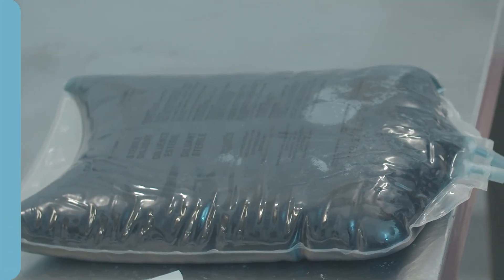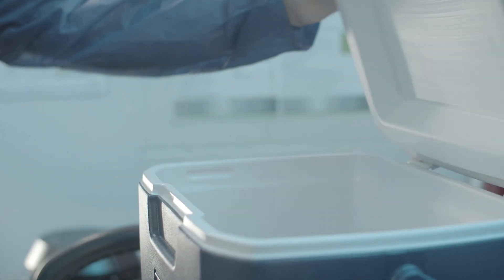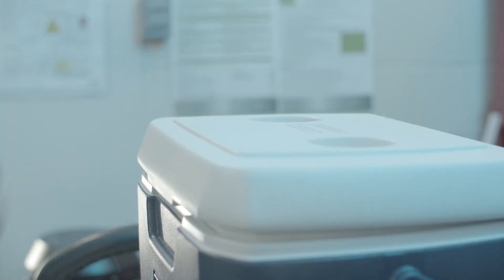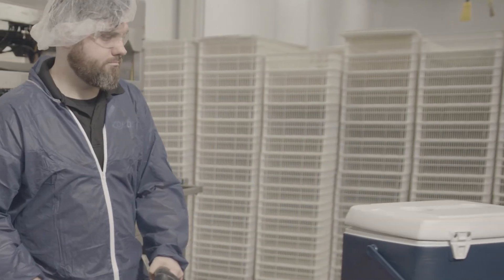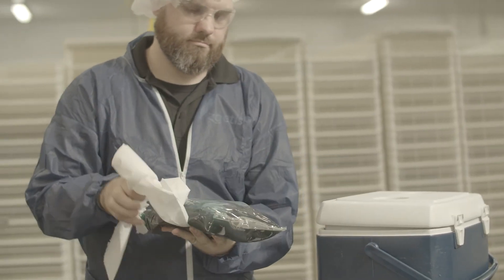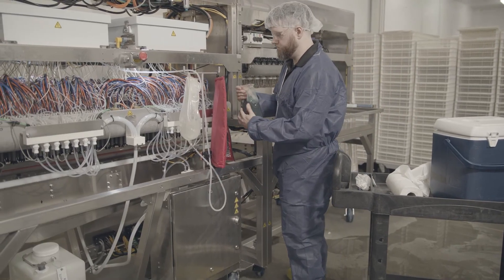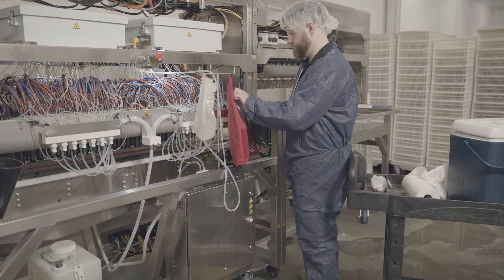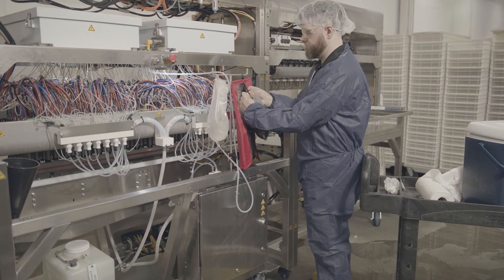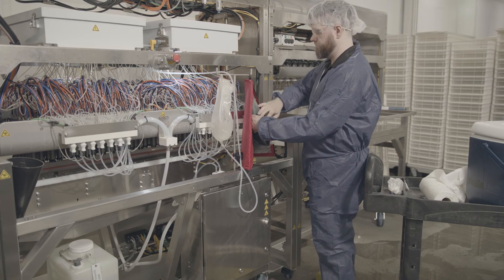The vaccine is ready for use. After mixing, place the vaccine in a cooler with clean plastic-covered ice packs to help prevent the vaccine from getting warm. Transport the vaccine to the vaccination device in the cooler and keep inside until ready to hang in the device. Dry the outside of the bag thoroughly with a new clean paper towel before hanging. For Marek's Innovoject, place the vaccine bag in the intertherm bag with ice packs to provide ongoing chilling during use. Use aseptic technique to attach the vaccine bag to the Marek's BioDevice using the IV spike — this should be done by a designated clean staff member.